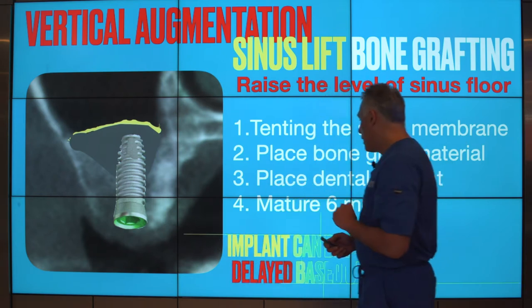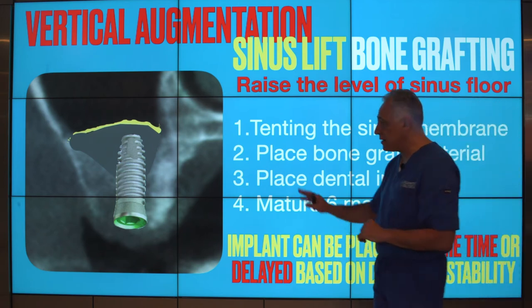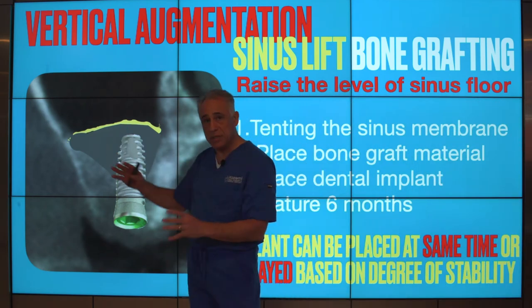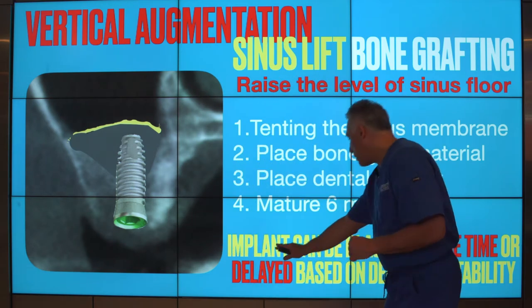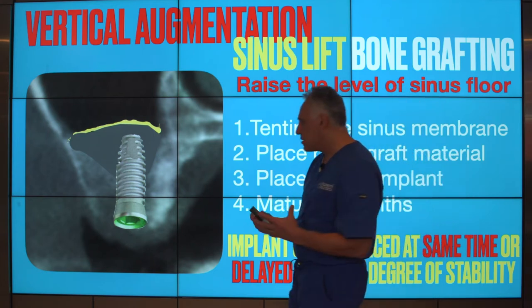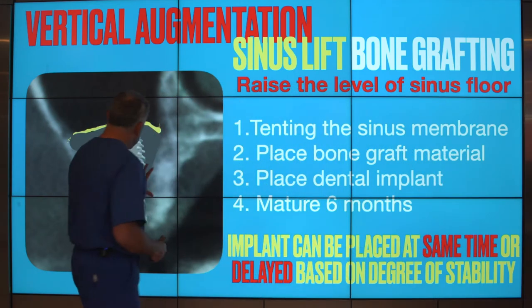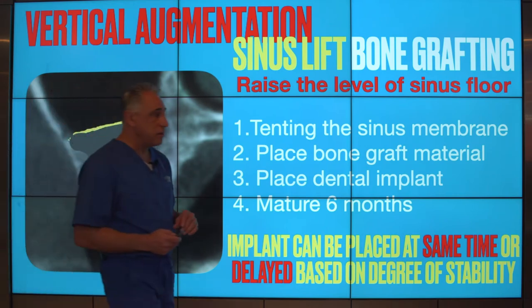Now, this procedure can be done either at the same time, meaning that the implant placement and the bone grafting can be done together, or in some circumstances, it must be done in a delayed approach. And this is really based on the amount of the existing bone and the primary stability of the implant.